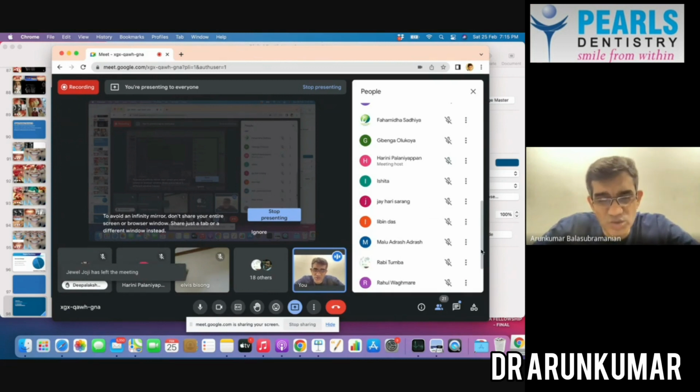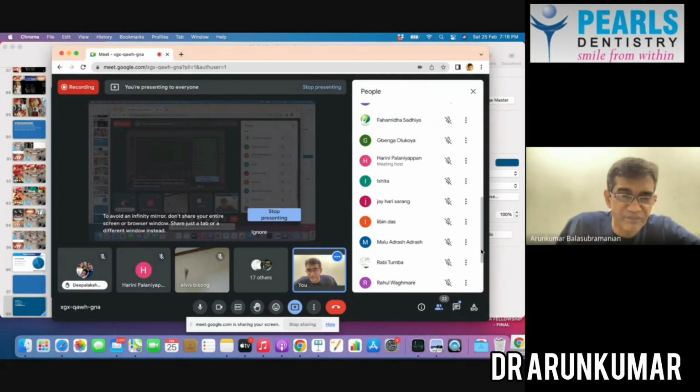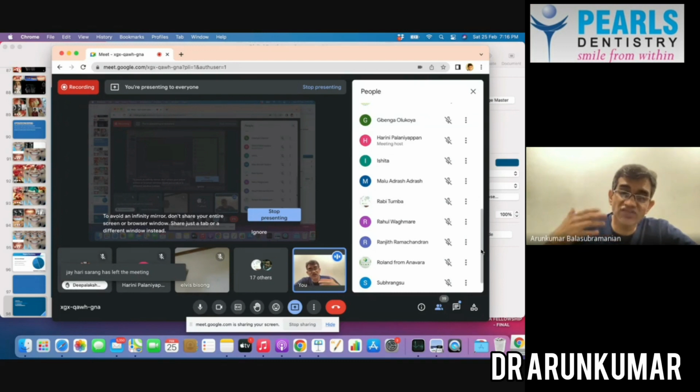The most common tooth implants we use are called root form implants. When I say root form implants, those implants and the tooth which we give on top of them look similar to our natural teeth. And when we choose an implant, it's very important. There are many commercially available implants in the market. It's better to go with the best implants that are there. When I say the best implant, I mean one that has been in the market for many years, with a lot of original research behind it, and that has been functioning in patients' mouths for a very, very long time.